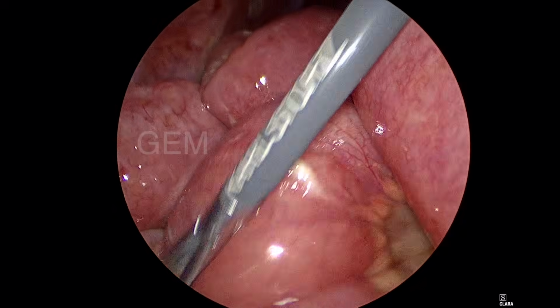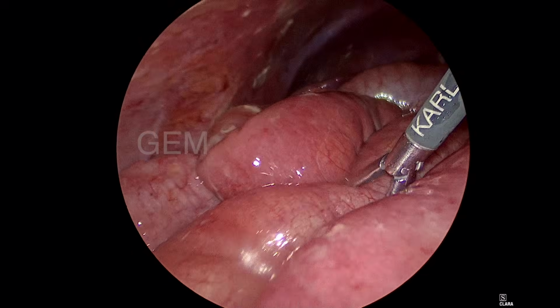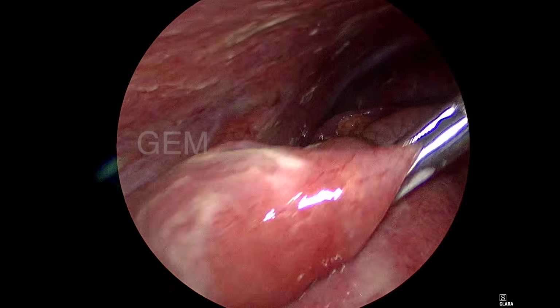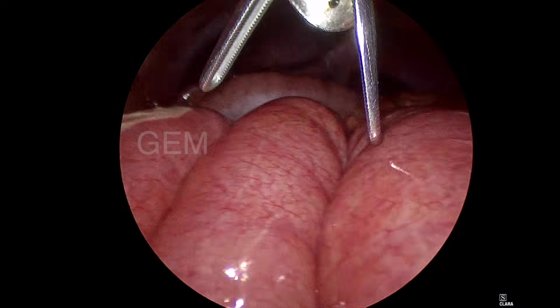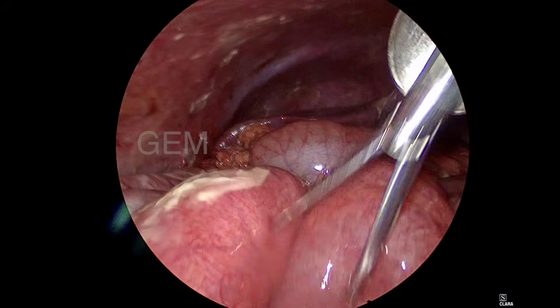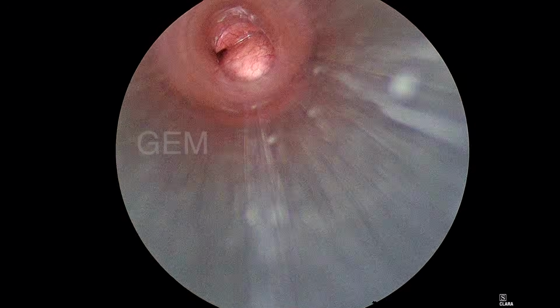I replace the bowel properly from the peritoneal cavity to the pelvis. Give some IV antibiotics, and the next day the patient can be discharged, or the second day, depending on the recovery of the patient and the bowel movement. So this is the way we manage appendix abscess with generalized peritonitis. Thank you.